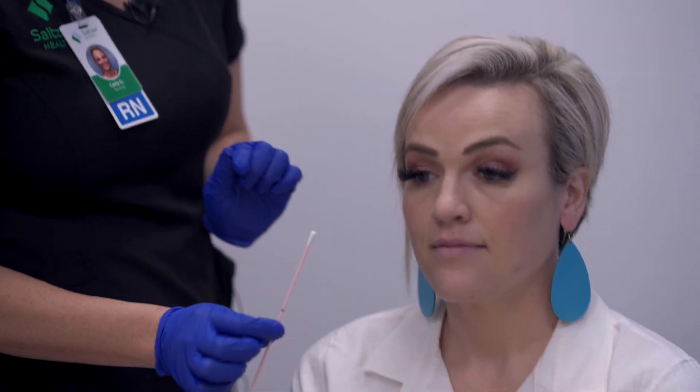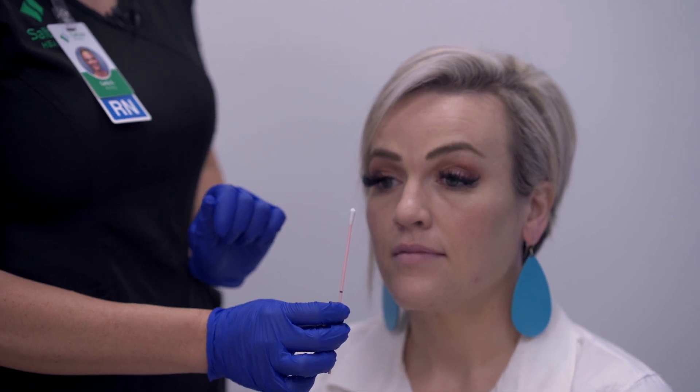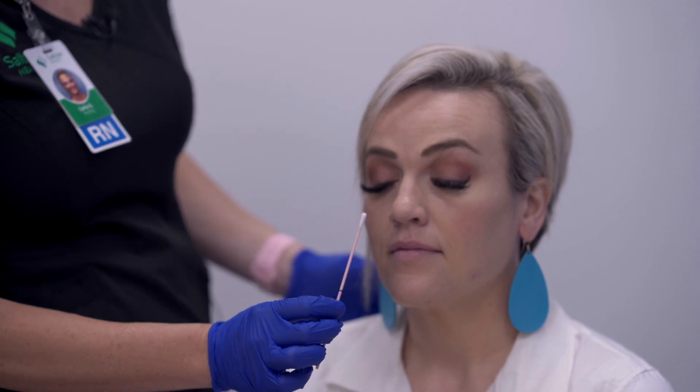To administer this swab, you want to get the swab into the first nostril about an inch in so that the full cotton tip is covered.